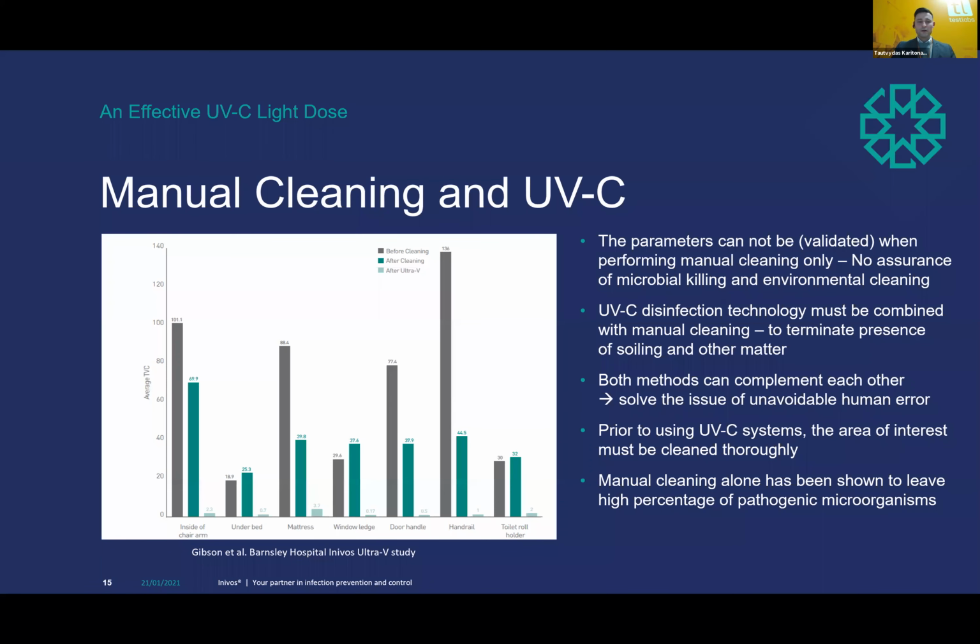So if we're trying to get the conditions as close as we can to the conditions from the test laboratories and all the reports, we may have a better chance of getting the same level of efficacy. I suppose what we are calling for is for more tests to find out exactly what other parameters do influence that Z value. So when you look at those reports, you're able to make sense of them: if these are the claims being made, we really need to make sure that those UVC technologies or devices are actually effective in the setting and they actually are used as intended.